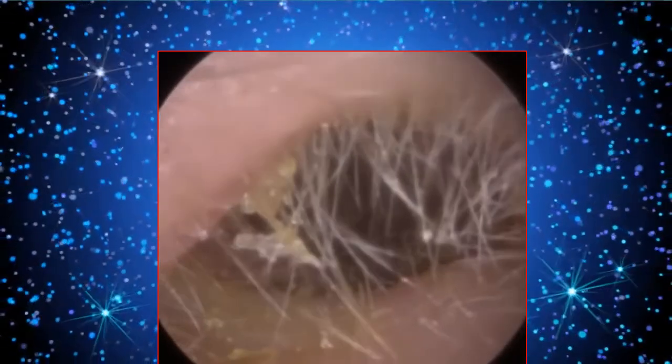Onto the left ear now, you can see quite a few cilia at the entrance. There is quite a lot of dry earwax here as well, but it's not as occluding, I would say, as the original right ear. In the right ear, some of the dry wax was really lodged immediately against the eardrum, whereas this is more lateral, so near the entrance and mid-canal. Slowly but surely, we're just wriggling out this dry wax.